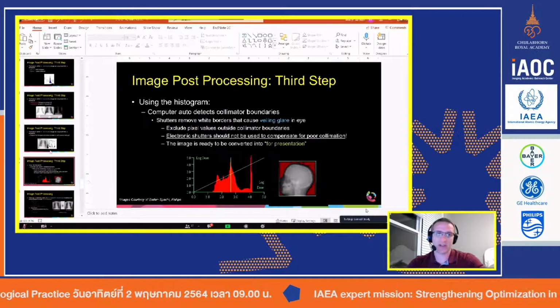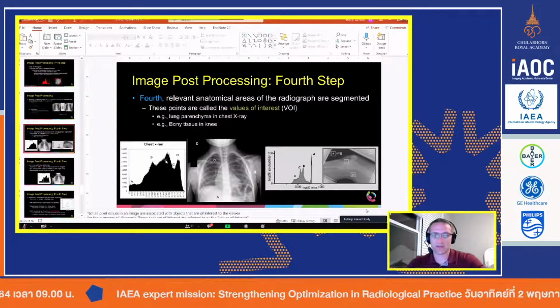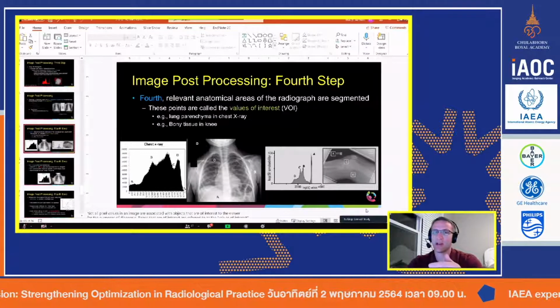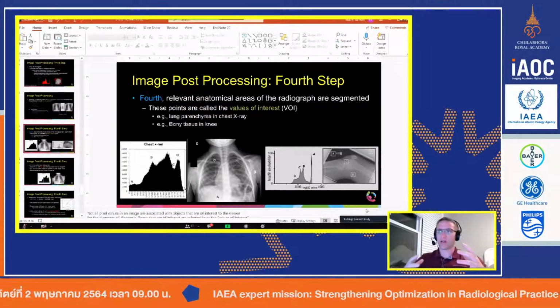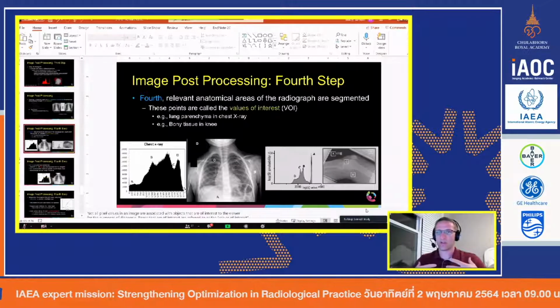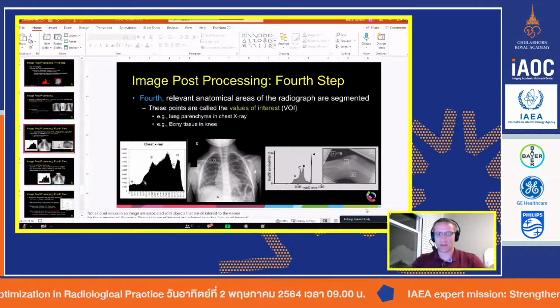All right, those are great questions. Let's go back to this slide right here. The very first thing is that a chest histogram will largely be the same for adults and children. When you get to be teeny, obviously the overall histogram will be smaller, but assuming normal pathology, we've got two lungs and our normal bony structure. Even if it's smaller, assuming you've also collimated smaller, this histogram will largely be the same.